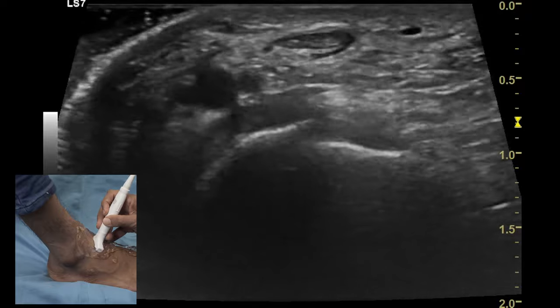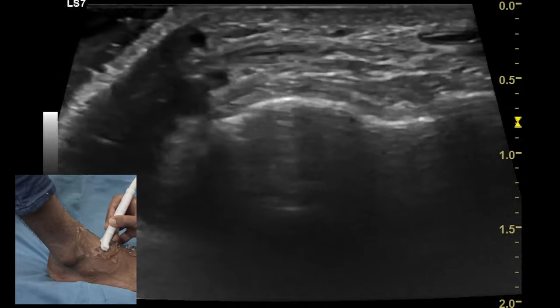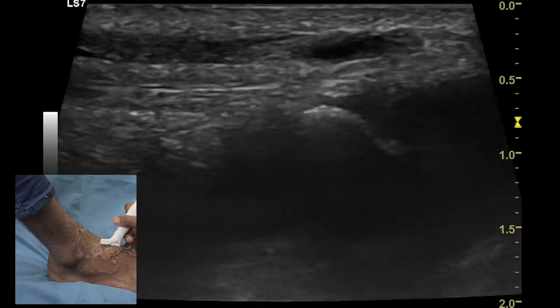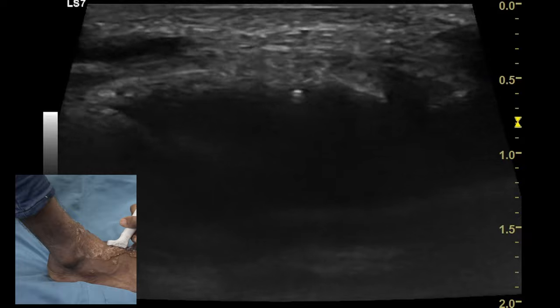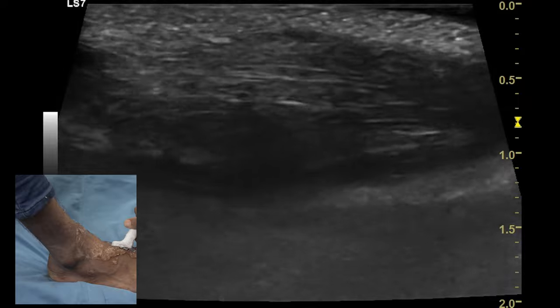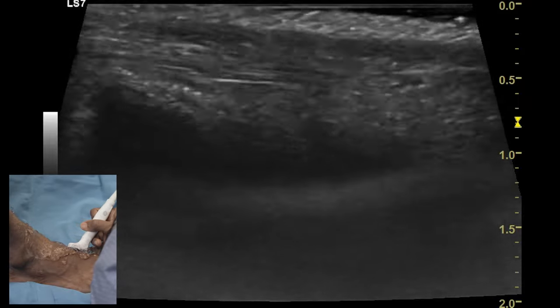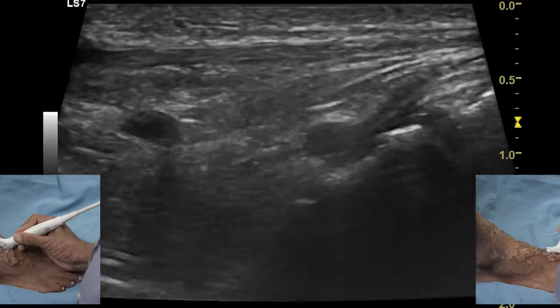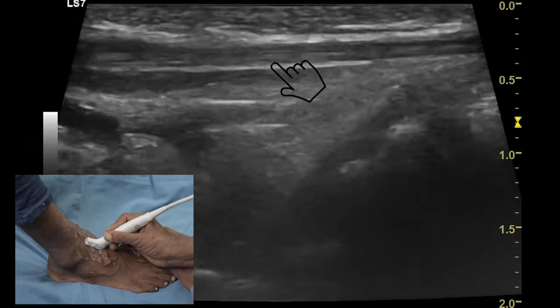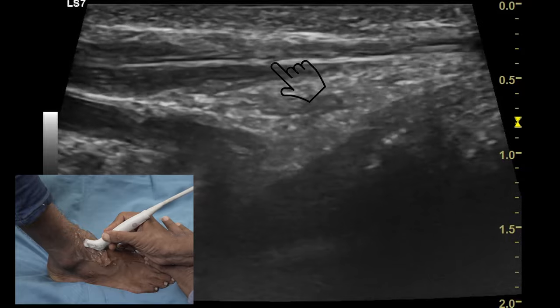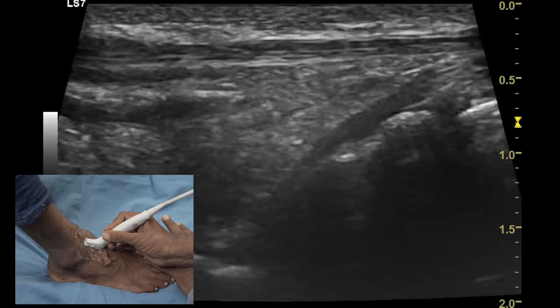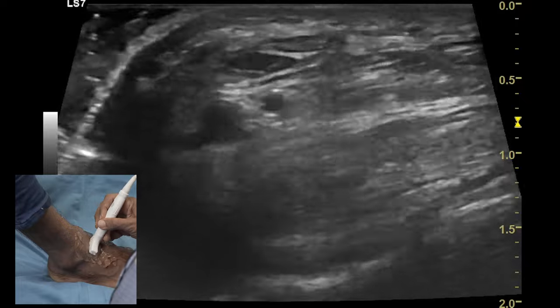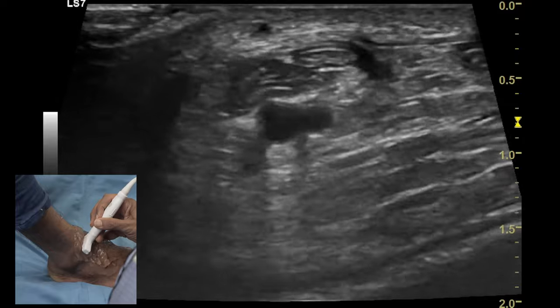Once the transverse examination of the extensor hallucis tendon is over, we need to turn the transducer 90 degrees to look at this tendon in a longitudinal plane and follow it distally all along its way till its attachment over the dorsal aspect of the distal phalanx of the great toe, to evaluate the integrity of this tendon. Dynamic examination of this tendon can be performed by doing a passive movement of the great toe to look at the excursion of the tendon, which should happen very smoothly in anterior-posterior as well as superior-inferior direction.